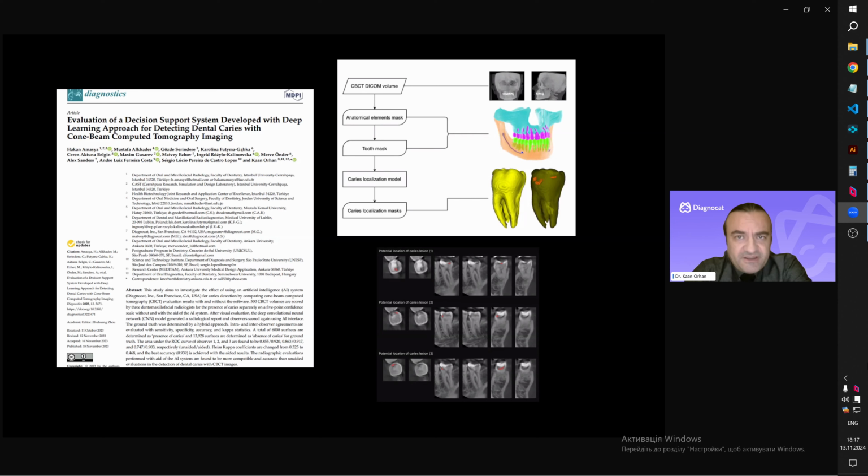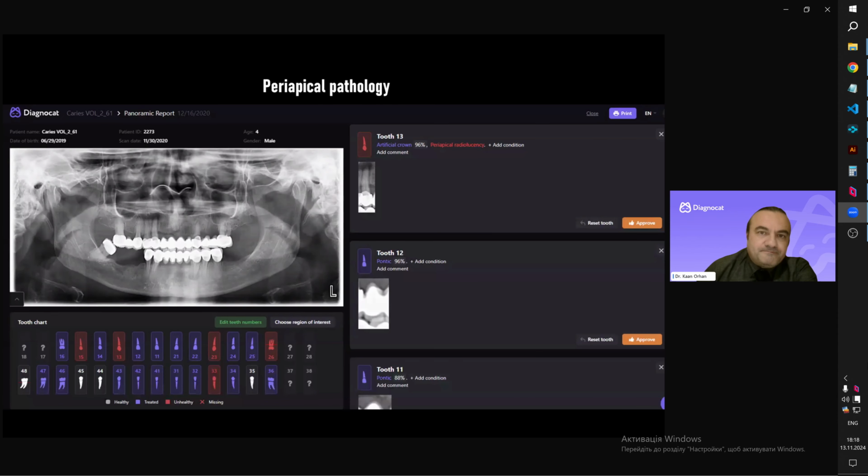If I were lecturing in this webinar a couple of years ago, I would have told you: please try not to make any carious diagnosis from CBCT because of these artifacts. But right now we are using AI models to reduce the artifacts, to erase the artifacts of the CBCT, and we can figure out especially the secondary carious lesion and the carious lesion from the CBCT volume. So right now, there's another option and tool for carious diagnosis.